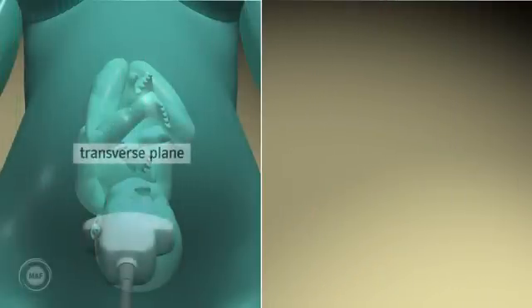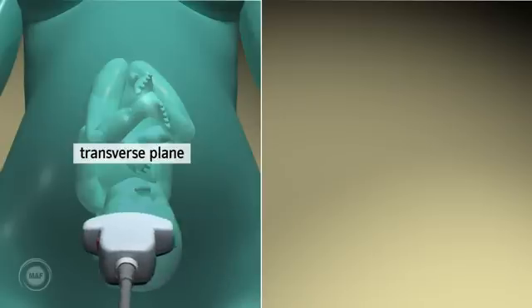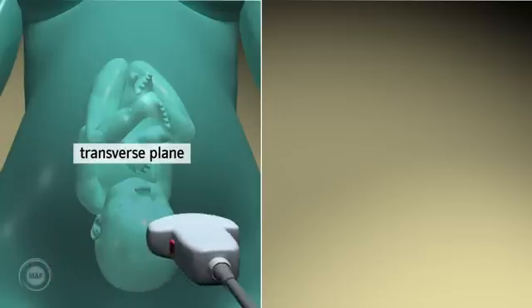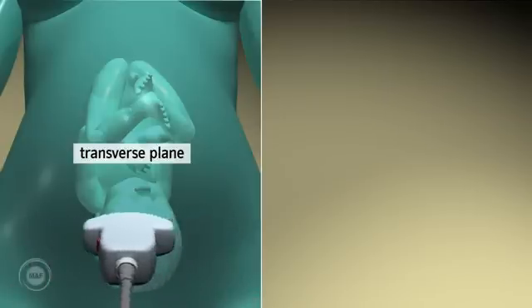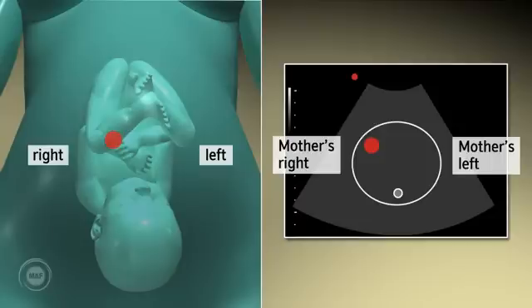When scanning in the transverse plane, the image on screen is like a mirror image. The left side of the mother is represented on the right side of the screen, and the right side of the mother is represented on the left side of the screen. Again, the location of the dot on the screen should correspond.